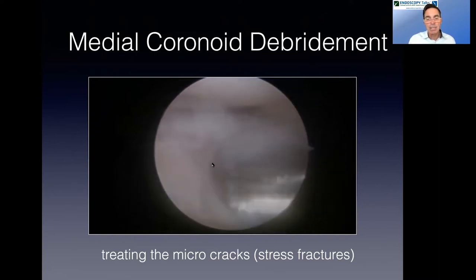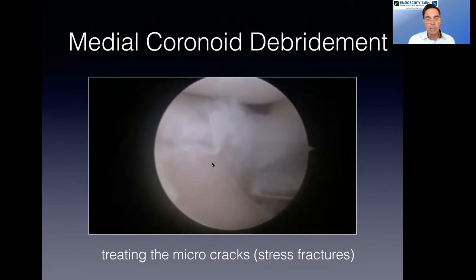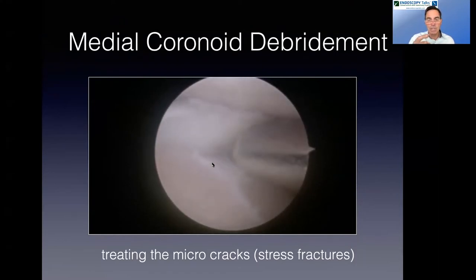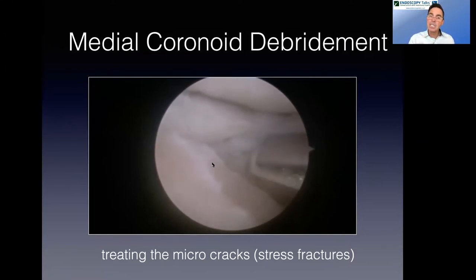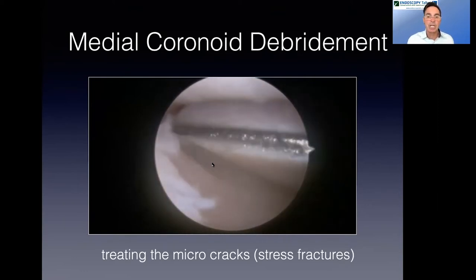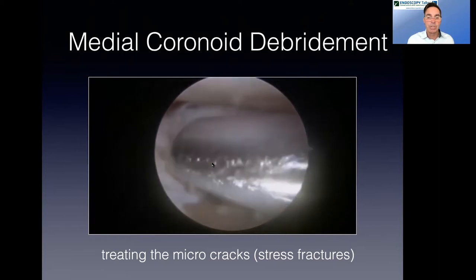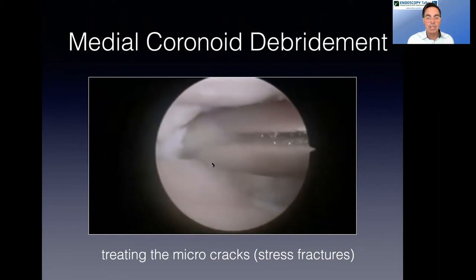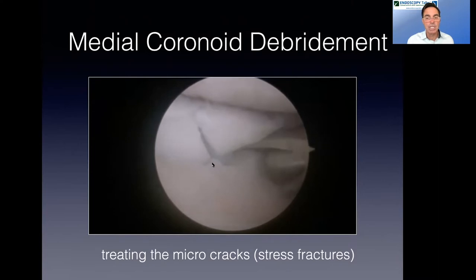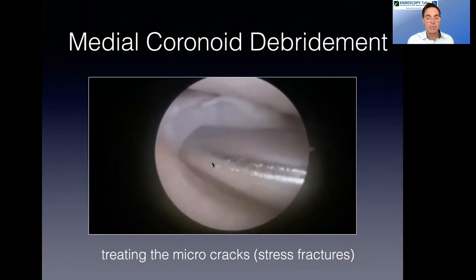So once we get back to nice solid bone, you can see we're just kind of finishing it up here. What this does is it gets rid of the bad bone or the microfracture bone to relieve pain. But in addition, it creates more space so that we can go in and remove our two fragments without causing that iatrogenic damage. So again, we've just about finished treating that bed. We're going to get that little point off right there. And now you can see our fragments are much more accessible and they're going to be much easier to remove.